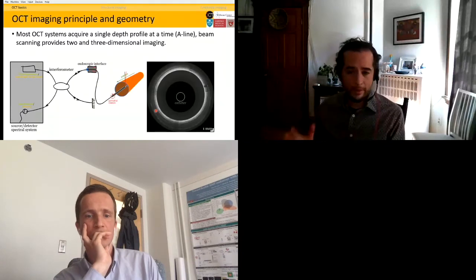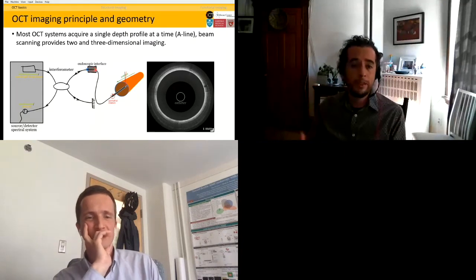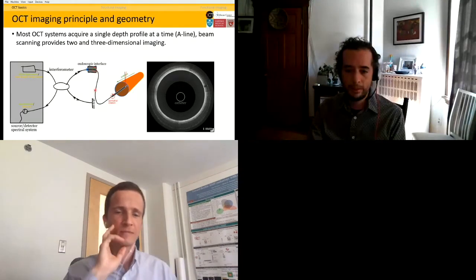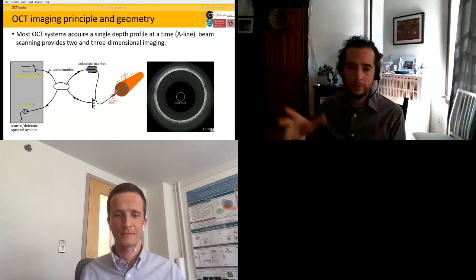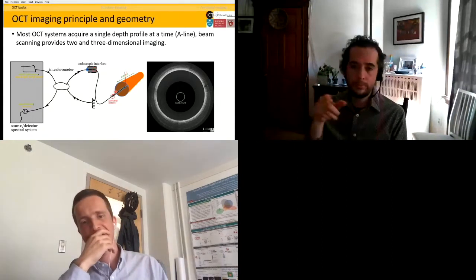And more interestingly, we can also couple an OCT system with an endoscopic interface in order to essentially have coupling of the light that we have in the sample arm between a static fiber that is connected to the interferometer and a rotating fiber that is connected to an endoscope. So this allows us to scan luminal organs with an endoscope from the inside of the organ, and we can have 2- and 3-dimensional scanning by azimuthal rotation and also by pulling back motion.